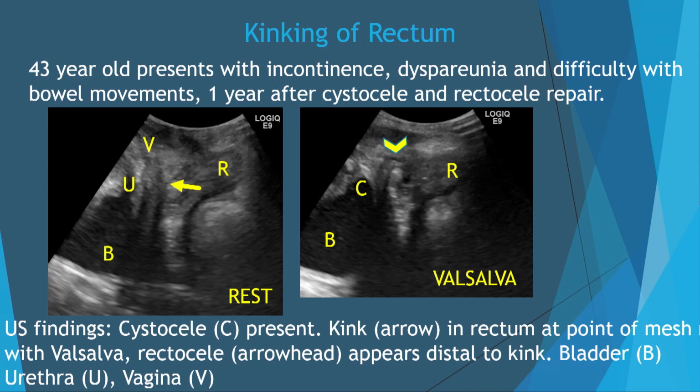This next patient actually came in primarily with urinary problems, and she does have urinary problems. On her bladder, you notice that she forms a little cystocele with valsalva. However, because of the appearance of the rectum, I then started asking her about her bowel movements. And immediately she said, oh yes, after she had her surgery, she started having real problems being able to evacuate her bowels.